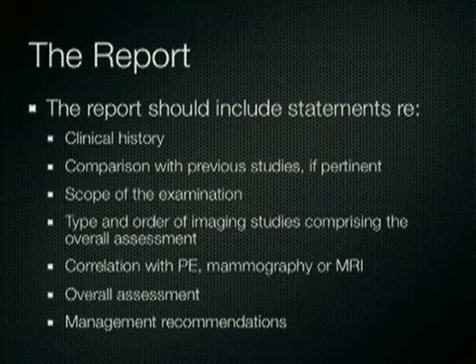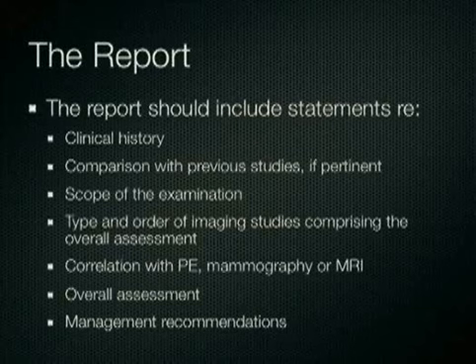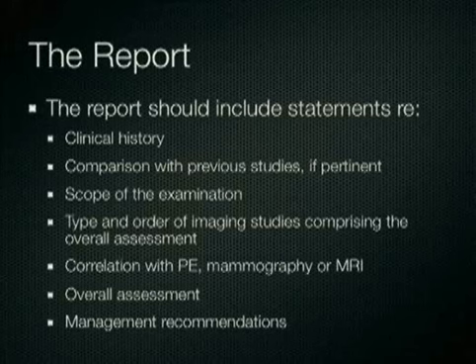The report of the ultrasound findings should reference the clinical history, prior studies if available or pertinent, the studies imaged and evaluated, the types of other imaging studies that are included in the overall assessment. Most often this will be mammography, but may include correlation with other imaging studies such as MRI, concluding with an overall assessment category and appropriate management recommendation.